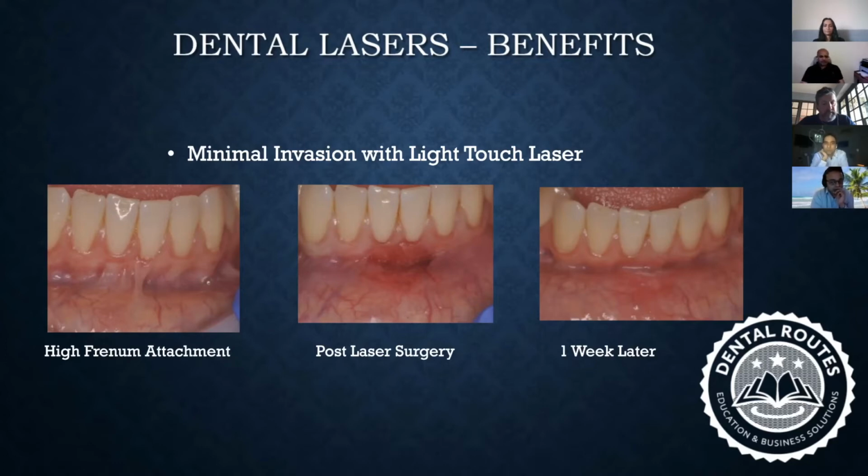The healing is much, much better when you're using a laser, because whenever you're using a scalpel or a bur, at the end of the day, what you're doing is you are creating some kind of trauma to the tissue that you're using it on, and that trauma would then lead to the same kind of healing process as any other injury to your tissues, right? The same phenomenon of inflammation and healing and everything else. But when you use a laser, it breaks that pattern. It breaks that pattern by first inhibiting the nerve endings from communicating the pain the same way a scalpel or a drill does. That way, it minimizes the amount of instant inflammation within the structure.